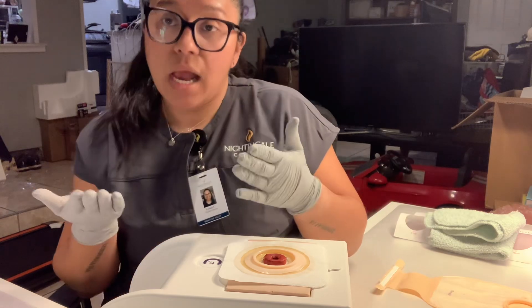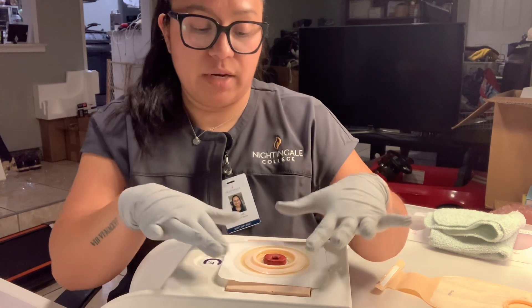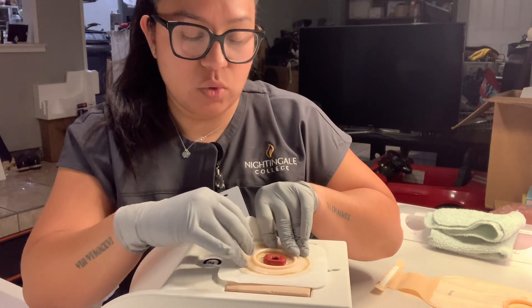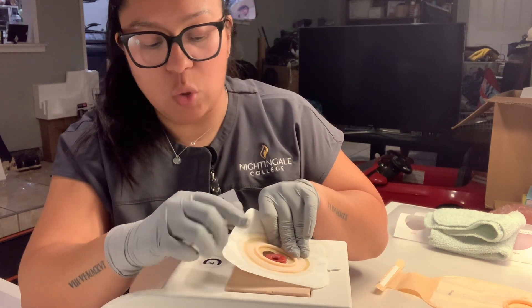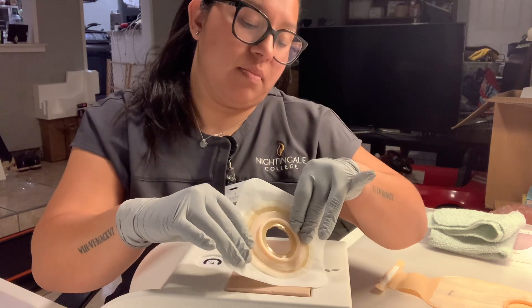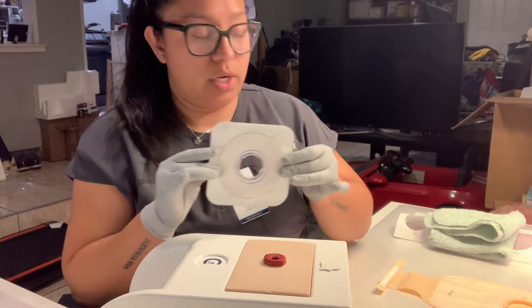Now we're going to go ahead and remove the base plate of the colostomy bag. We want to make sure that we do it gently to not irritate around the stoma more than what it's already, or to prevent irritation. This will now also go in the trash.